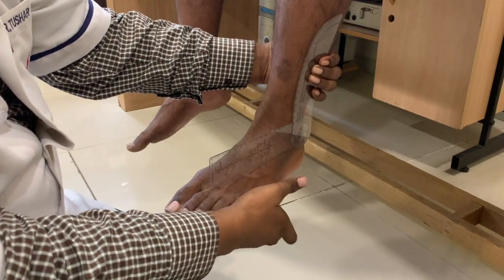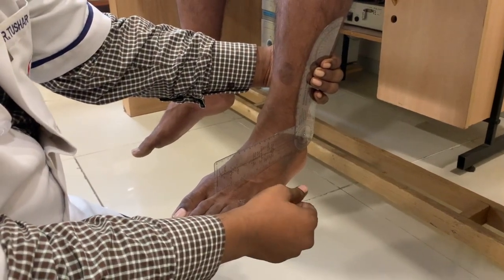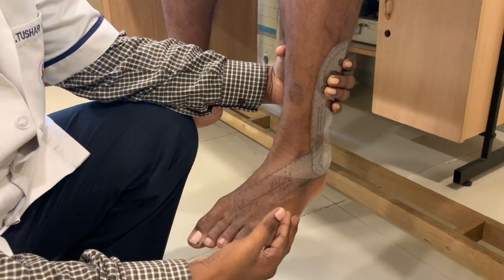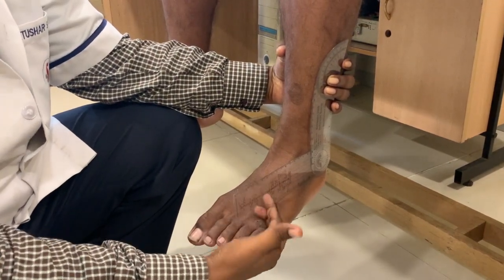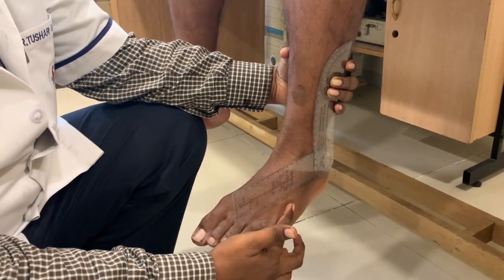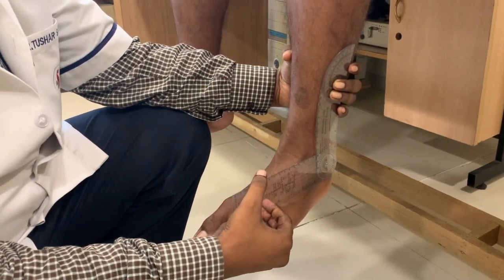So this is the initial starting position. Here we'll take it in the neutral position. To maintain the goniometer, you can keep two fingers in between the goniometer and the lateral aspect and the anterior aspect of the fifth metatarsal, and you can hold it here.